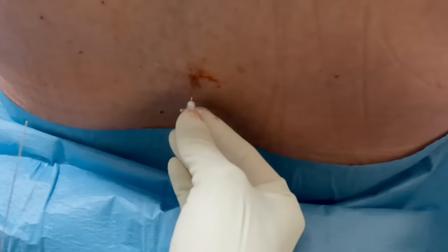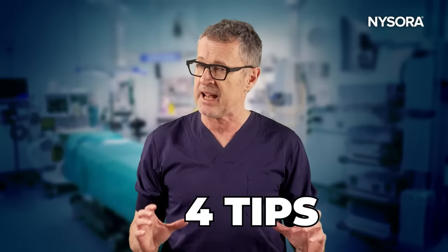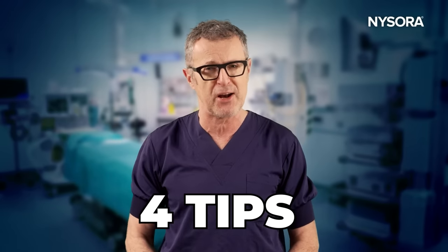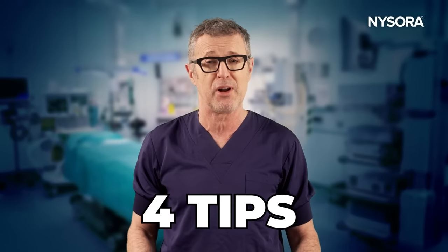In this video, you will learn four specific tips and techniques that will make your next spinal anesthesia or lumbar puncture much easier and more predictable.